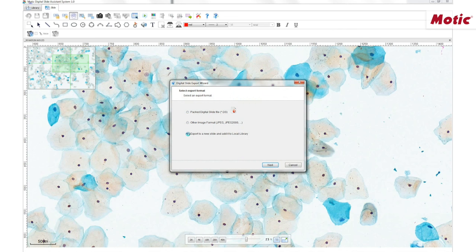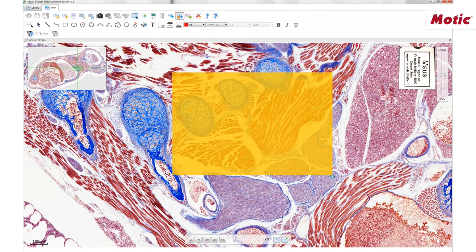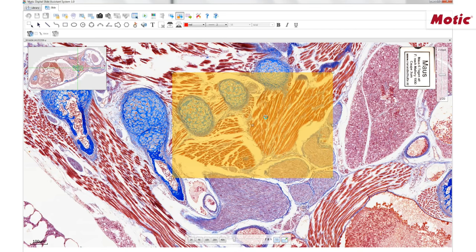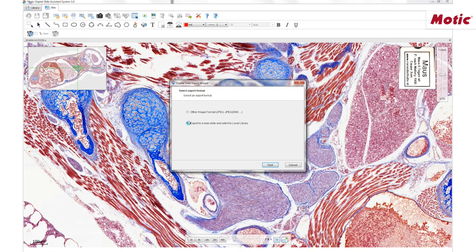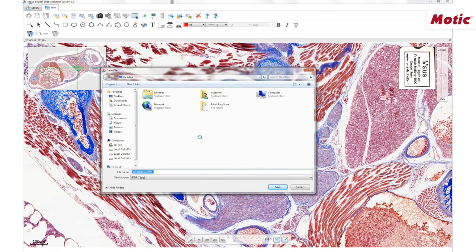Finally, we can also export a copy of the current slide and this will also be a DS format. Exporting a ROI, a region of interest, is another interesting function of this software. This option allows us to export a DS format but only from a selected part of the slide. The exported file is still an interactive image, but smaller files are originated, avoiding unnecessary storage memory. Click on Export ROI and select an area of interest, which will be highlighted in orange. Double-click on this area to access the exportation window. For a fast and easy ROI export, you can just capture an image and a JPEG file will be generated.